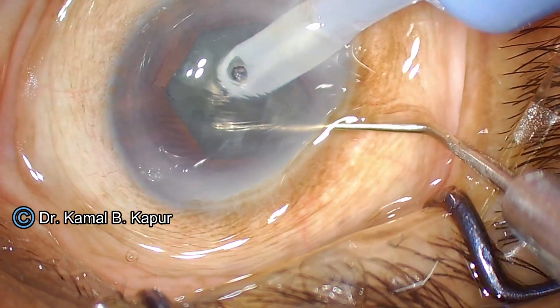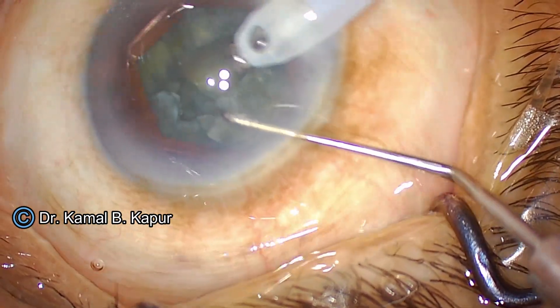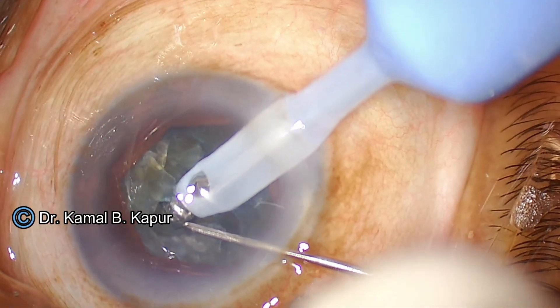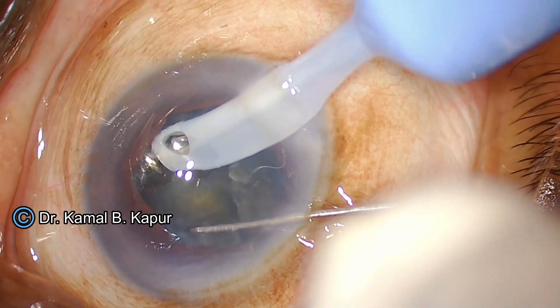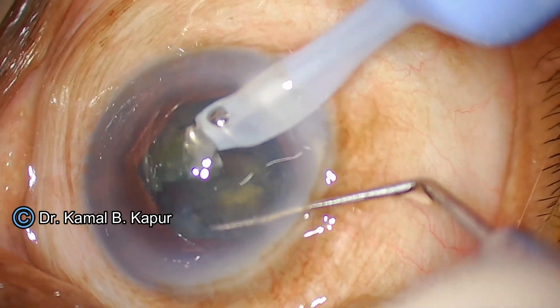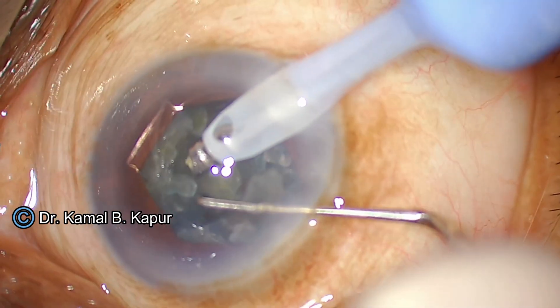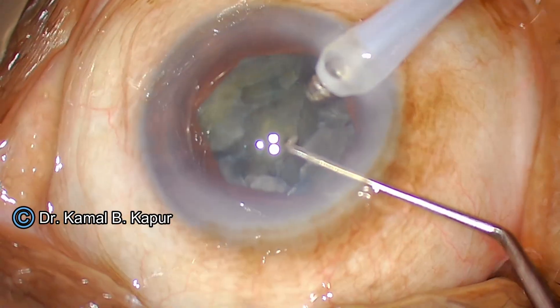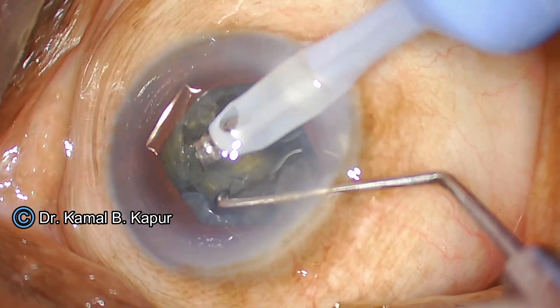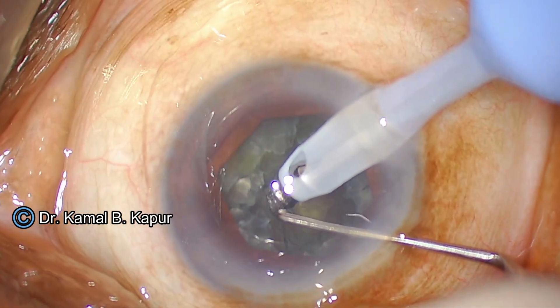I have achieved one small chop and created a wedge. Once the wedge has been created, I create one more small quadrant and then flip the cataract into the anterior chamber so that I do not need to work in the bag, which is already very loose. I am attempting to rotate the complete cortical plate along with the nucleus into the anterior chamber after creating small little segments.